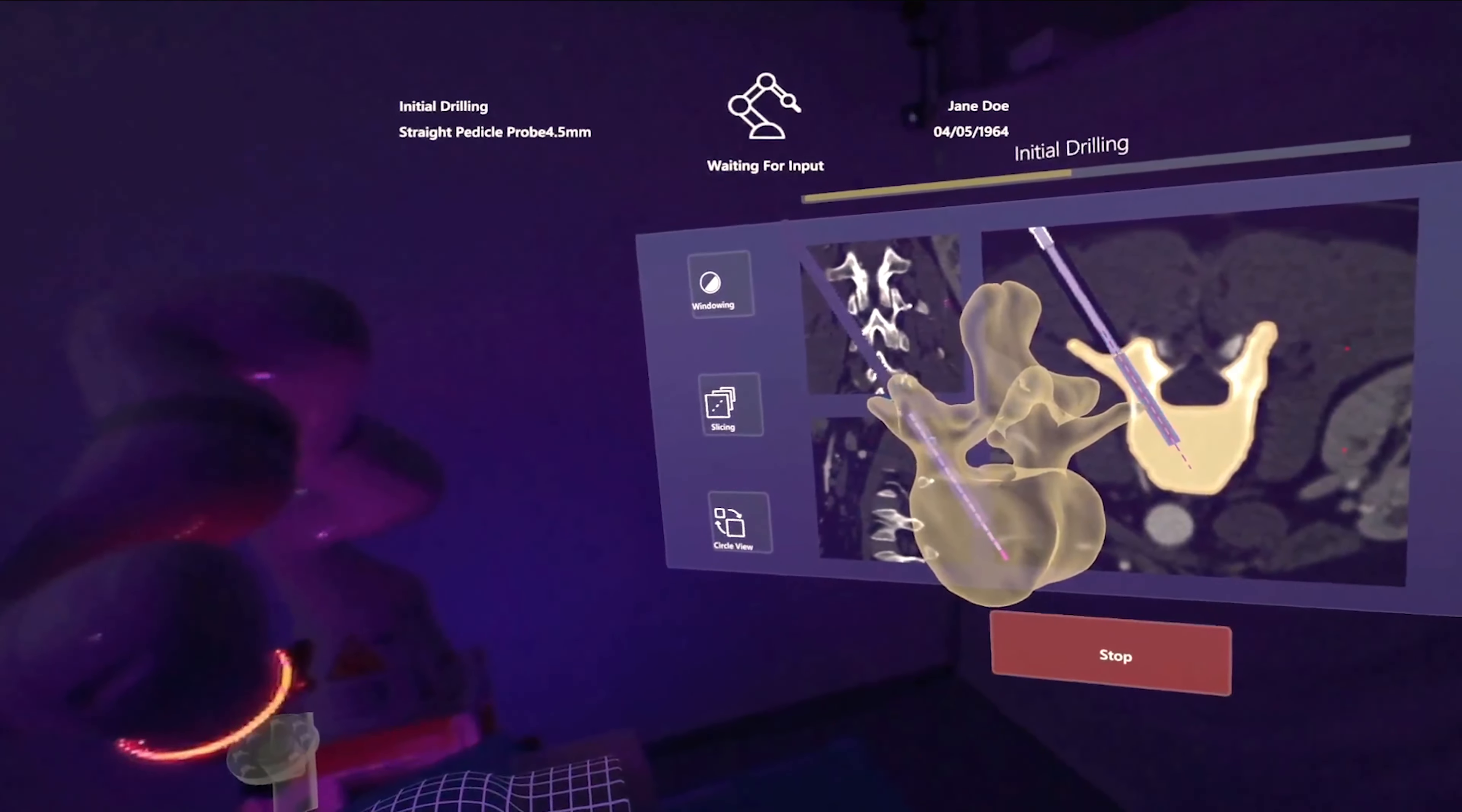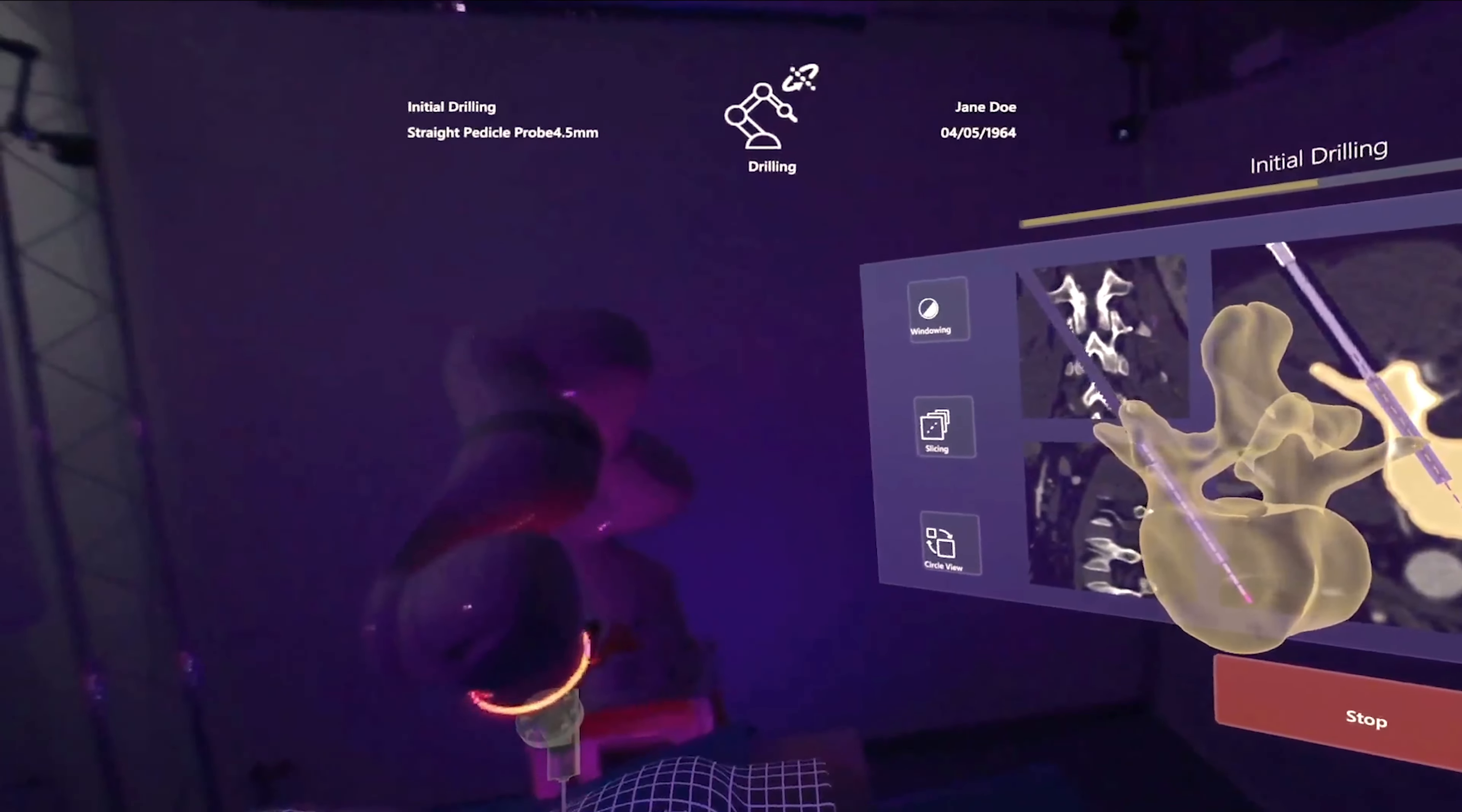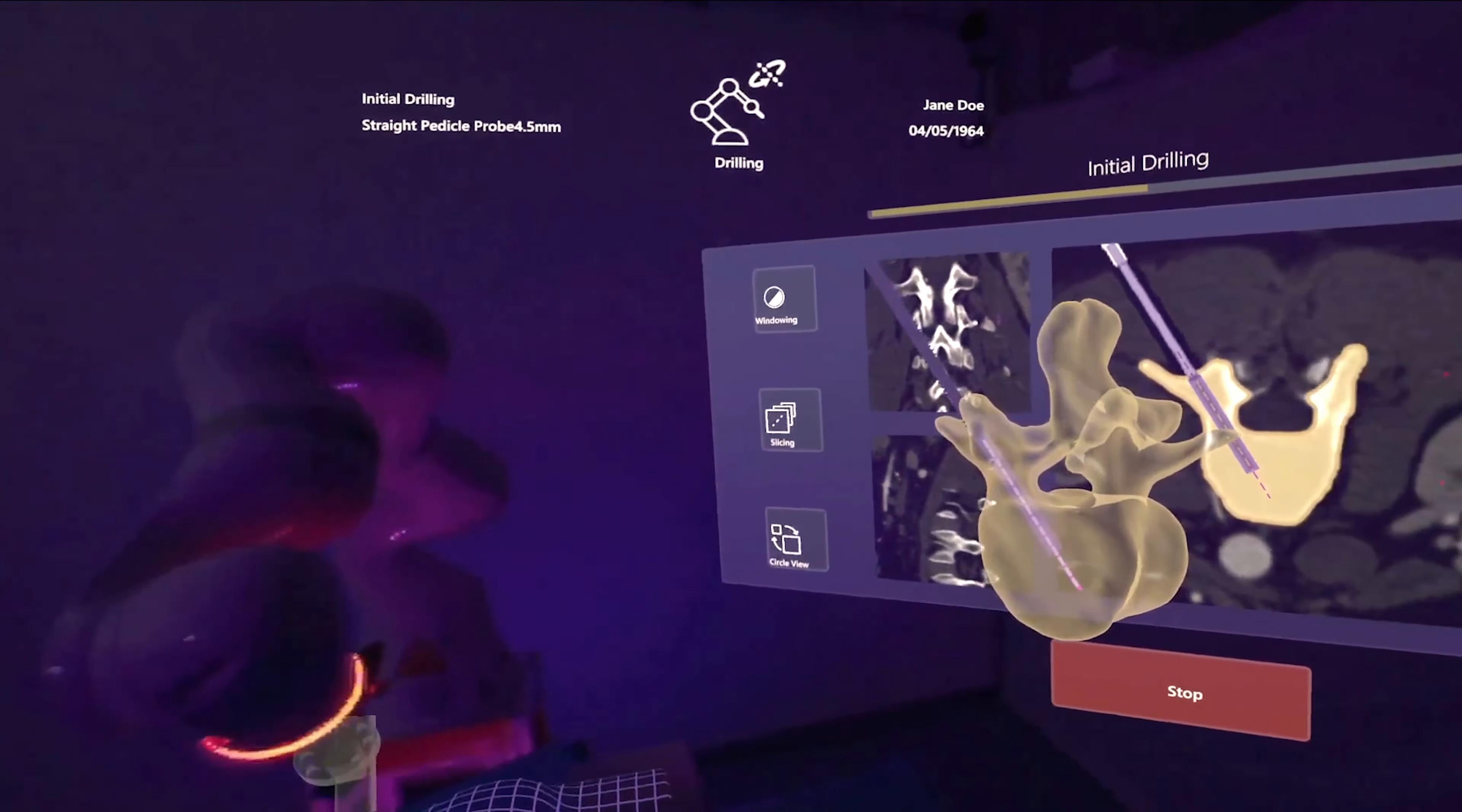Start. The robot drills into the vertebra by 5 mm at a time, acquiring and analyzing CT data at each step.